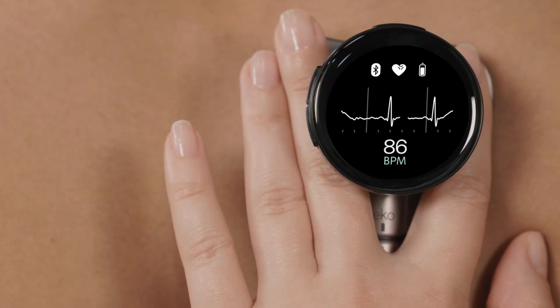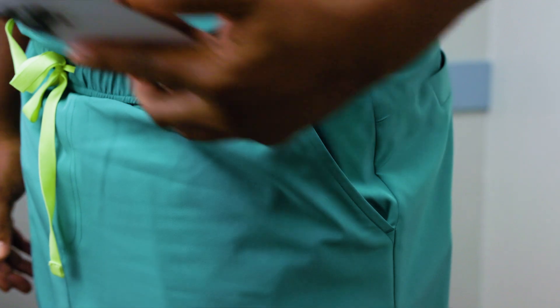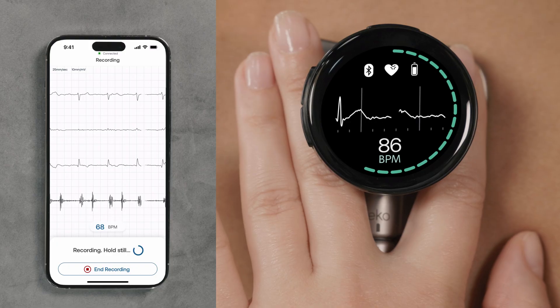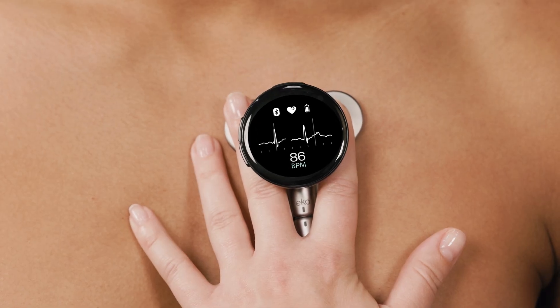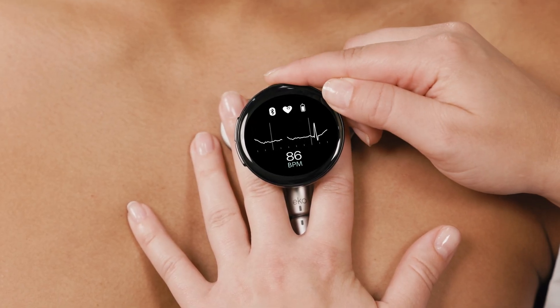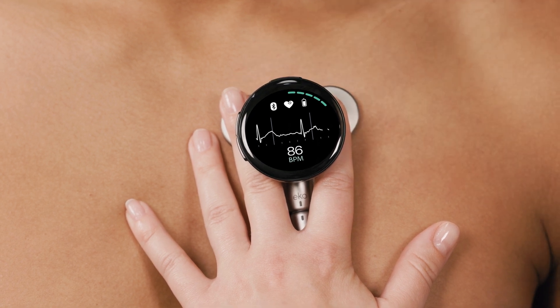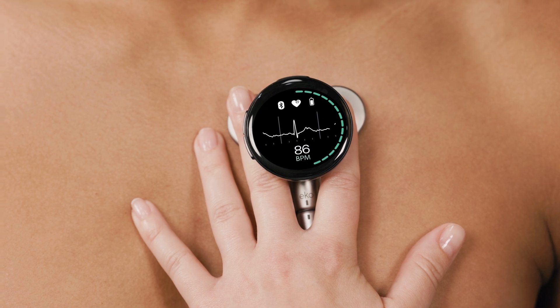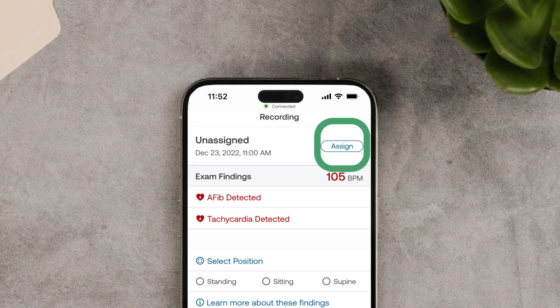Here's a tip. You can also start a recording from the Core 500 and keep your mobile device in your pocket. The device must be actively connected to the ECHO app. Press the top button for 2 seconds to start a recording. The bars around the screen light up green when recording is in progress.